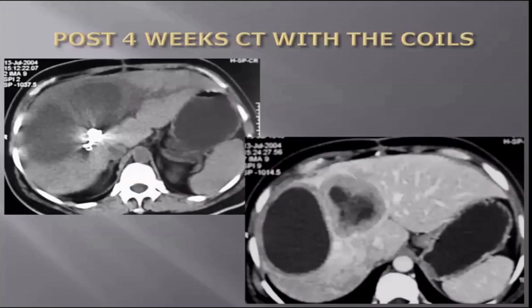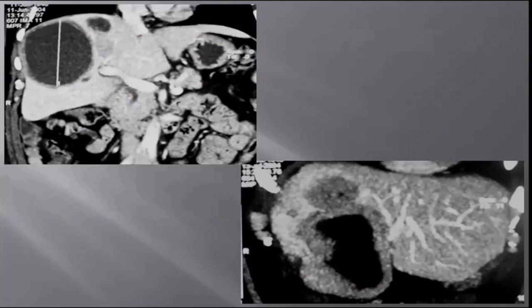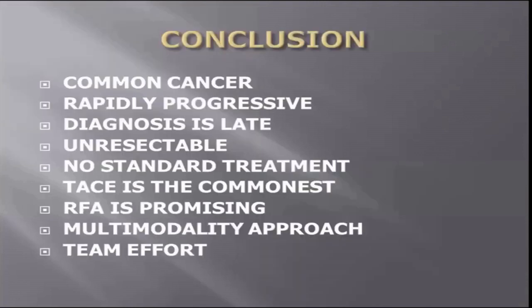And we have got very, very good results with our technique because we go to each branch and we embolize each branch. I think Gunjan, Raj, and Prasad will corroborate that whatever cases we have done for them, we have got pretty good results. And there's been a decent hypertrophy which has occurred, and they could go ahead with their surgery. And this is how it looks in this case, where we achieved compensatory hypertrophy.